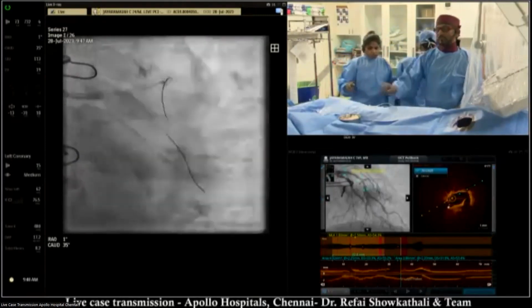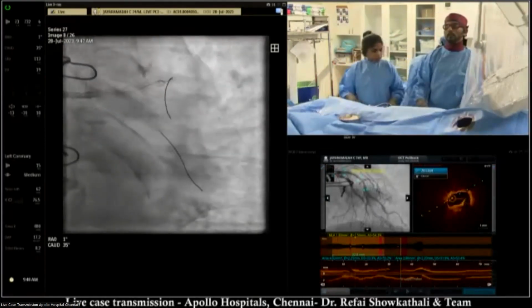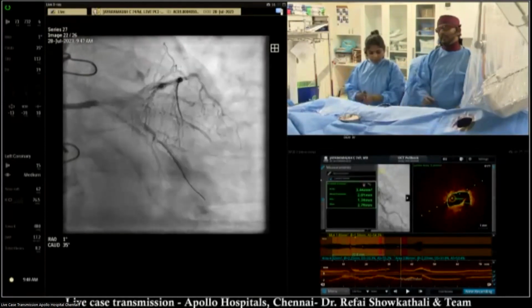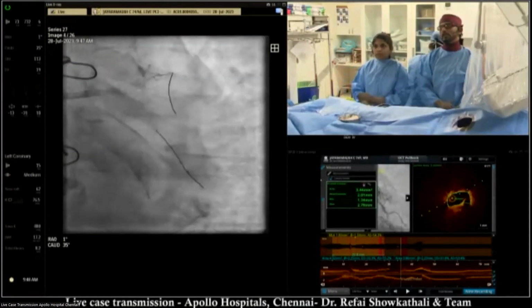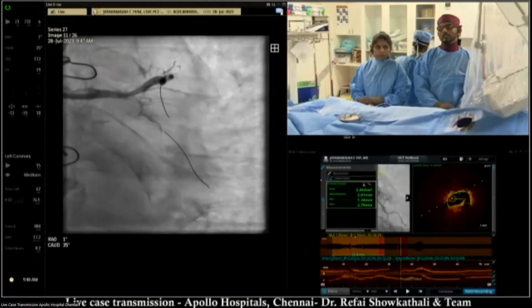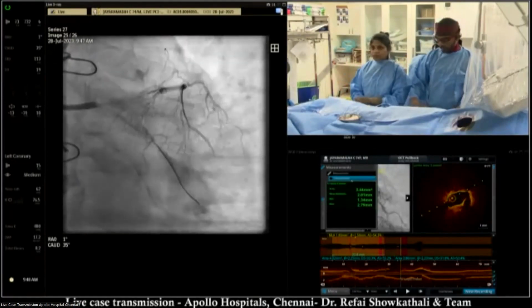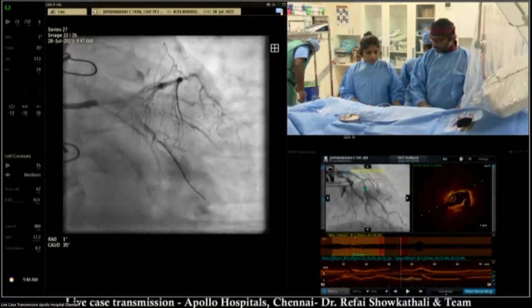That's a very valid point, because sometimes we get caught up with this 2.75, because remember it's a stent balloon and it won't go very high. Even if you go, it's around 3.1 at 22 atmospheres. So the question, as you rightly said, is that we may use a 3.5 balloon to prepare it, and make sure that it's fully expanded before we take the stent.